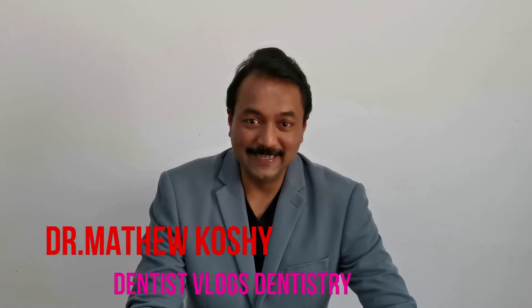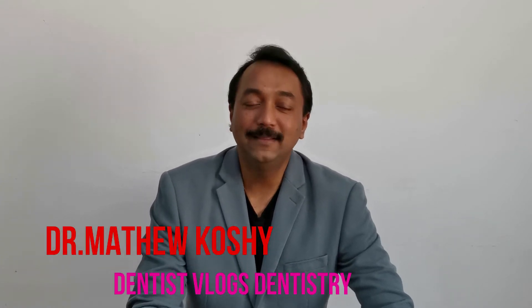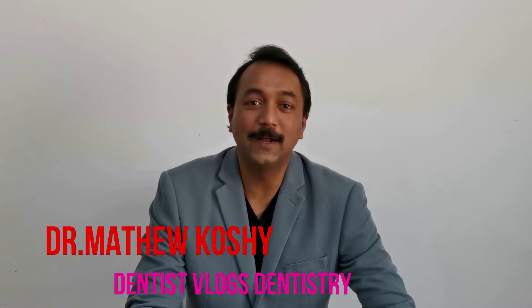Welcome back to Dentist Vlogs Dentistry. First of all a big thanks to you all for watching the first part of the unboxing of the Quick Sleeper 5 intra-osseous anesthesia delivery system. Let's continue with that.